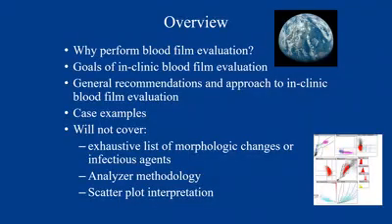So what are we going to cover today? We're going to talk about why we're performing a blood film evaluation. We're going to talk about the goals of in-clinic blood film evaluation. We're going to do some general recommendations and approach to in-clinic blood film evaluation. And then what I think is the exciting part are the case examples. And I have 6 or 7 cases that I hope to get through with you guys, kind of showing the importance of blood film review.